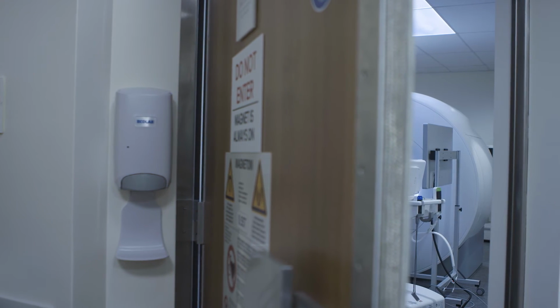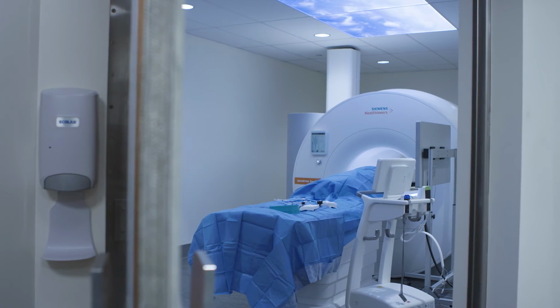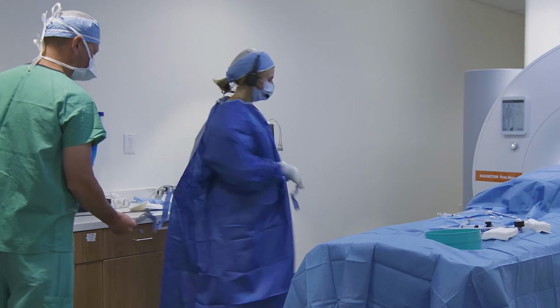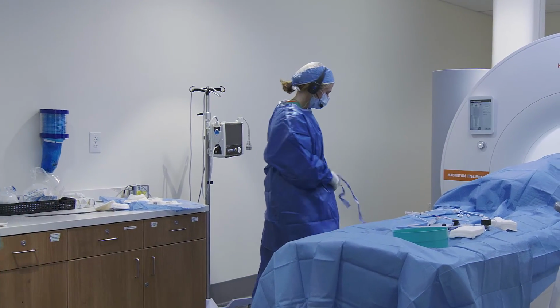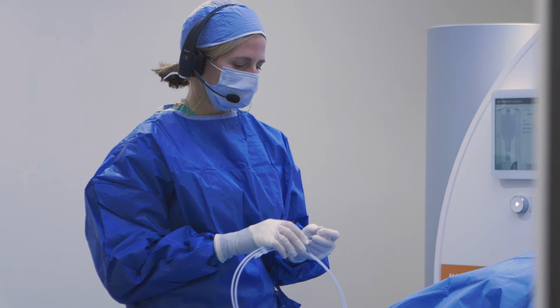We now have our first commercially available low field scanner, and this came out in 2020. This will change the field of ICMR because industry doesn't want to spend money on making the equipment because nobody's using it. But nobody's using it because we don't have the equipment to use. So we feel that low field MR scanning will change the field because we can use conventional equipment, because the magnet isn't as strong. It doesn't heat up the equipment as much. We don't get these huge artifacts. And if we can use the equipment that we already have with maybe some minor modifications, then industry is going to be more likely to partner with us.